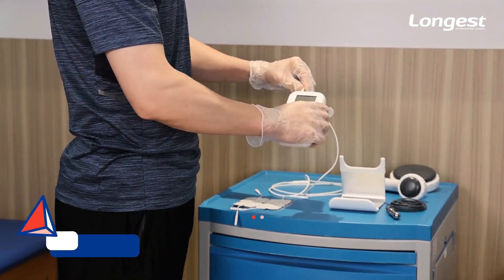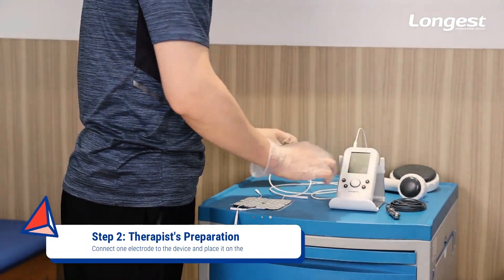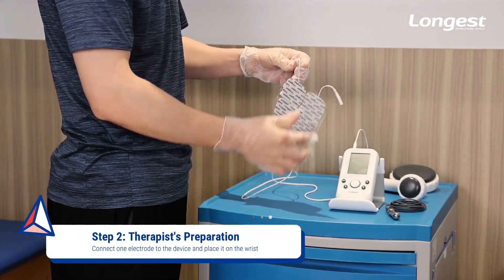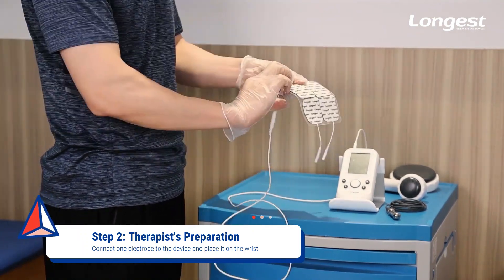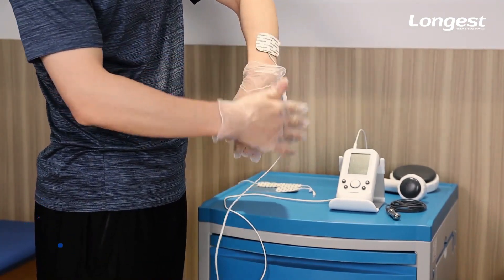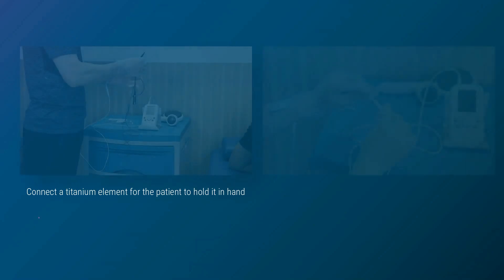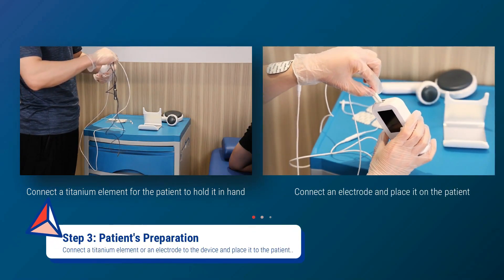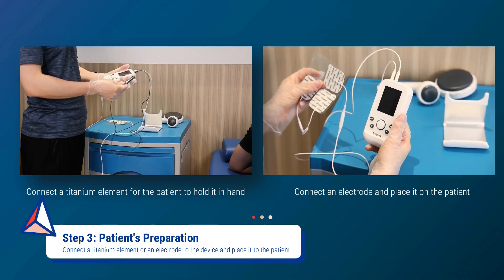Connect one electrode to the device with the lead wire, then place the connected electrode on one wrist. For the patient, either hold a titanium element in hand or place an electrode throughout the treatment.